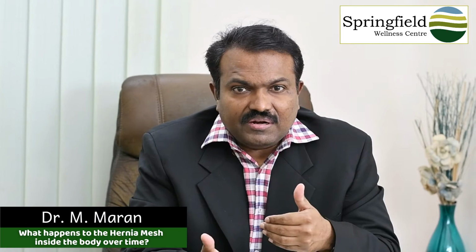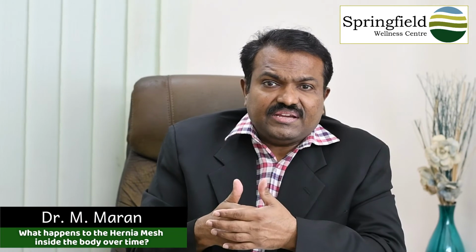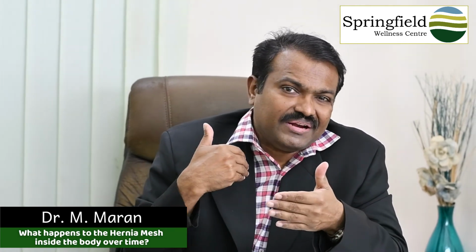The non-absorbable meshes are usually synthetic or animal tissue made. These synthetic meshes are usually polypropylene, with PTFE or other combinations of structures. If the mesh is kept superficially or in the inguinal region, where the intestine will not come and attach, it will usually be a plain synthetic polypropylene mesh. If the same mesh has to be kept somewhere in the abdomen where the intestines, colon or urinary bladder will come and touch it, then it will be a special mesh, usually non-absorbable, but with a coating so that other structures will not attach to it.